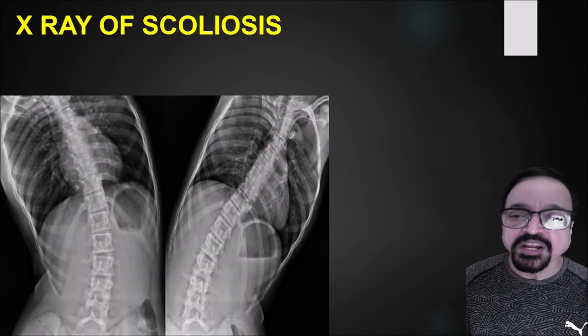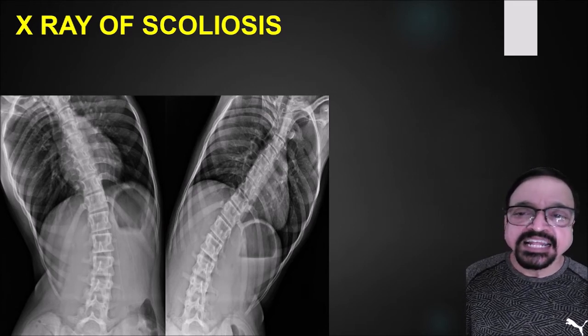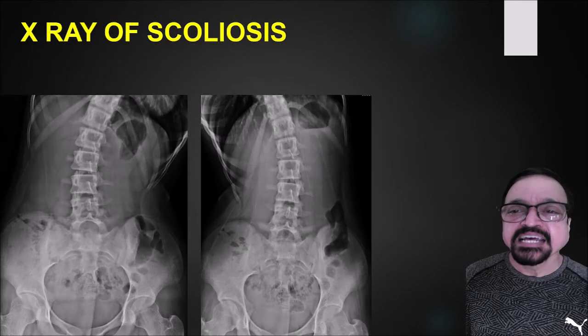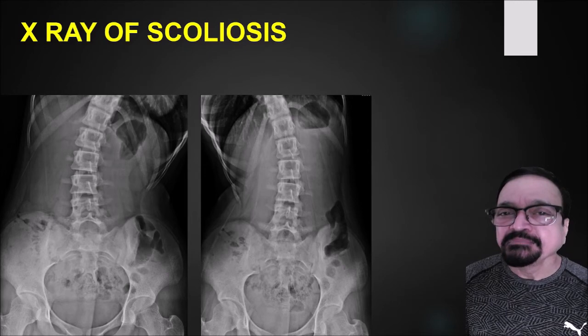This is the scoliosis workup. Now how to see the detailed angles of scoliosis is not a part of this lecture. They are covered in some other lecture and some other video. Here the basic aim is as far as radiographic projections are concerned. Now here we are seeing two different cases, worked up in different ways: AP and lateral bending.